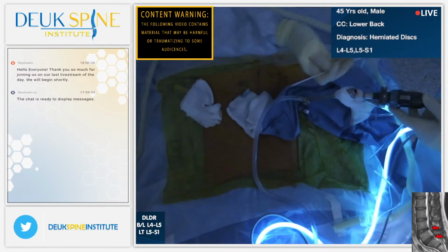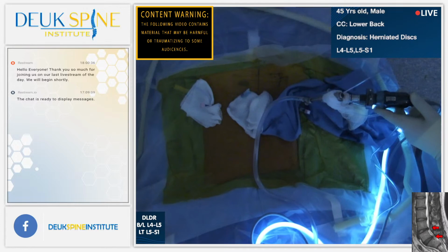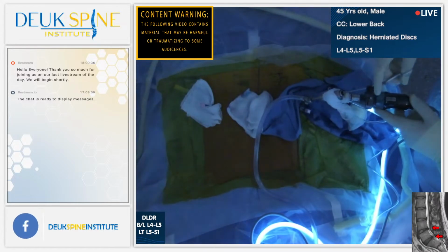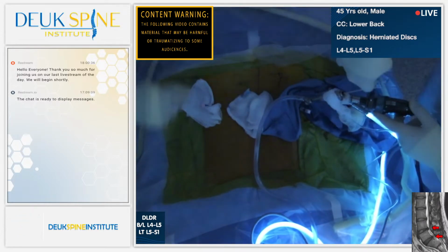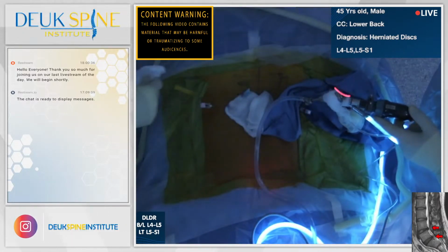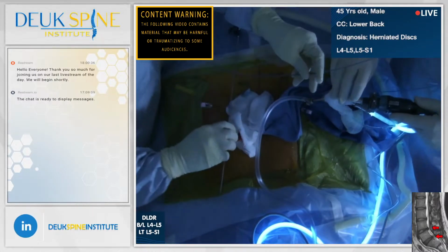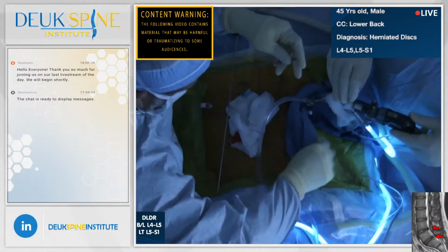Okay, anybody have any questions as we go down to fix the first disc of 2 discs with 3 injuries, 3 tears? Look at that thing. Look at that herniation. Laser. Any questions from our audience? No questions. All right, thank you, Sanjay.